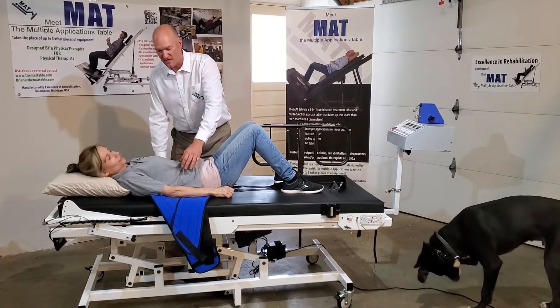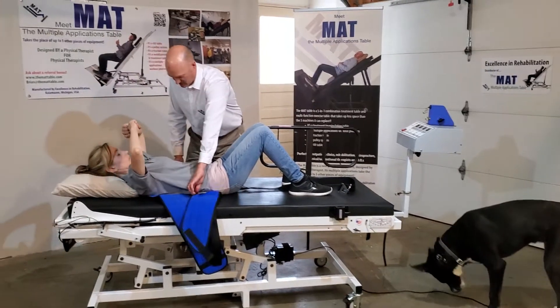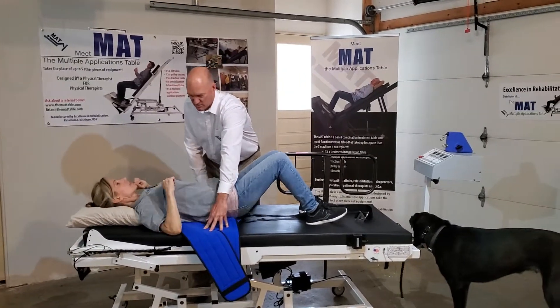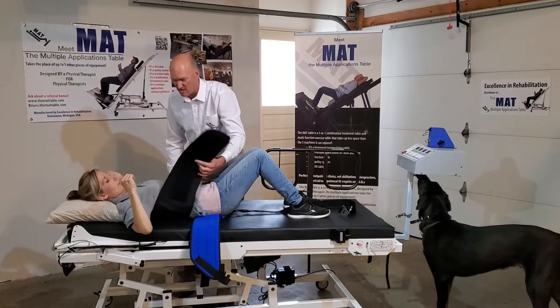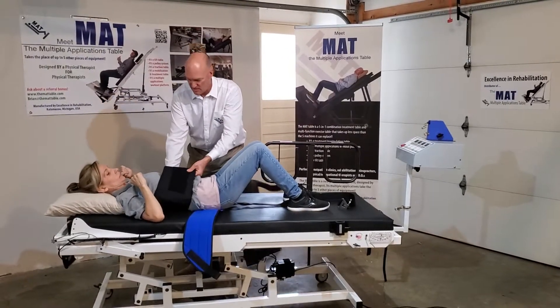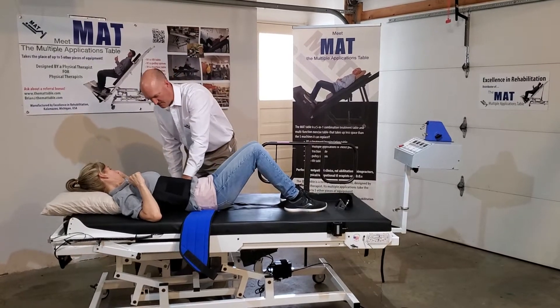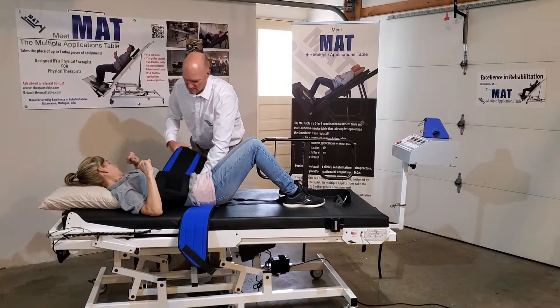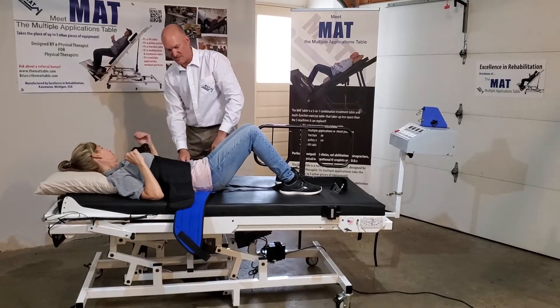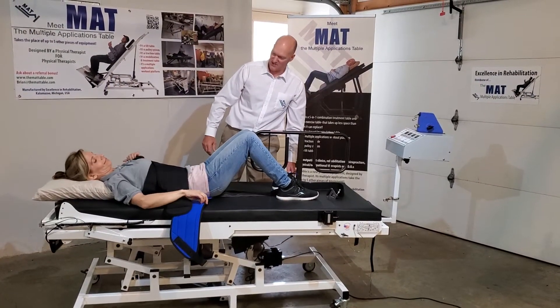Now I'm going to tighten up the thoracic stabilizing belt first. Will you slide up about one to two inches? That's about right — it should go right below the chest, across the abdomen. You want to get it as tight as comfortably possible.